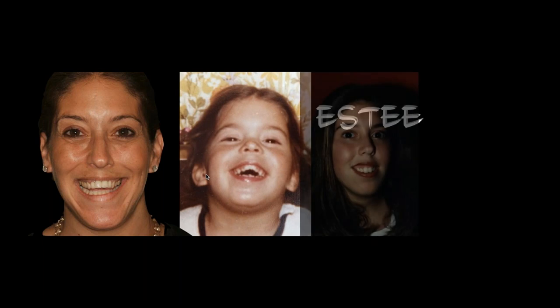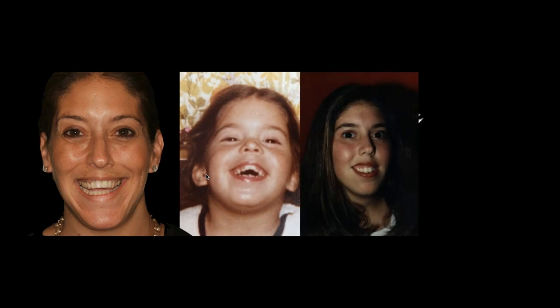And I remember my words were back then, she has two implants placed in the 8 and 9, by the way. My words were, put the implants to sleep and let's make her a 10 unit metal framework bridge. And everybody looked at me like I was a little bit nuts, to be honest with you. And that was in 2014.